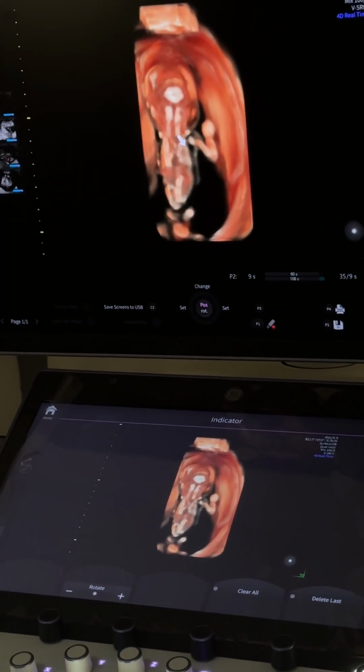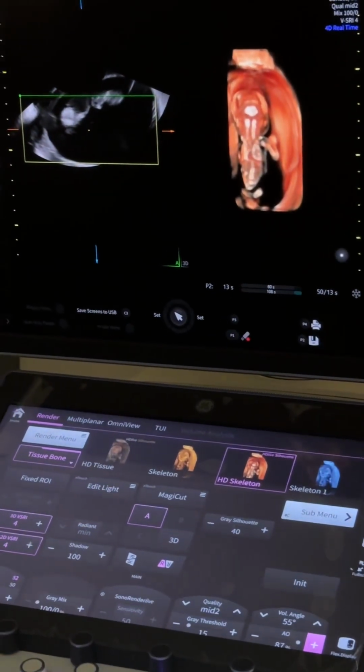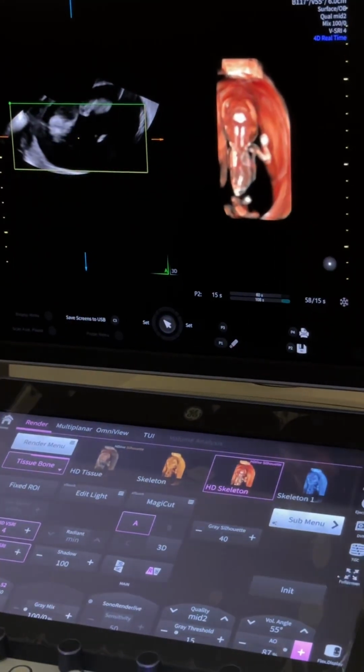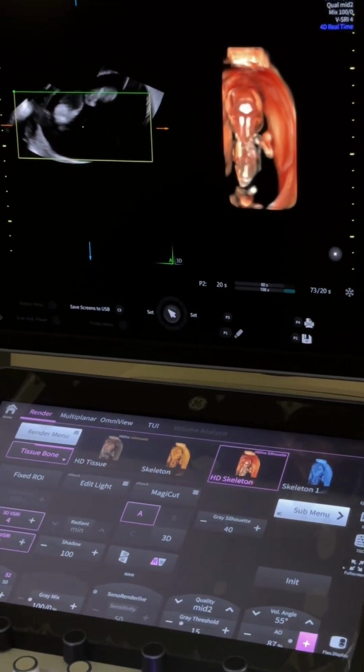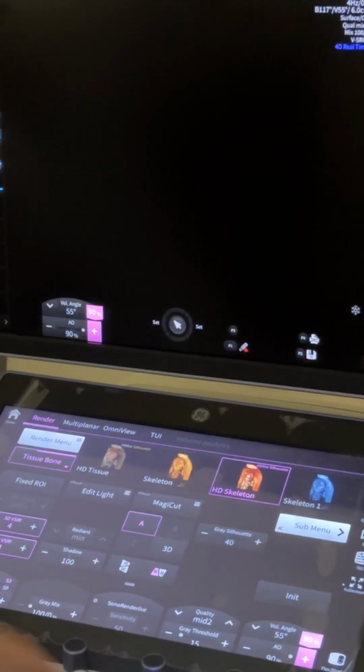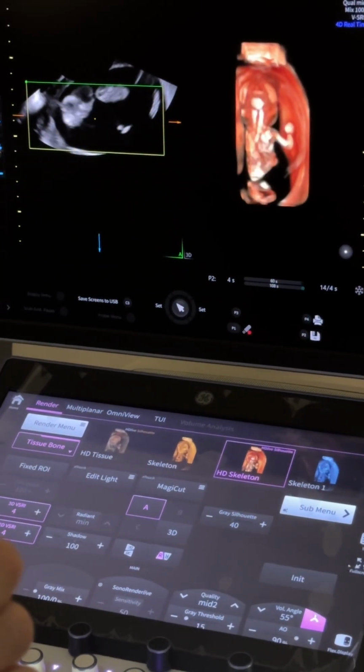If you wonder where you are, you can split the image, and you see that the baby is outside your rendered box, and you can change your render box. Bring that back in. How do I bring it in on real rendered? How do I get my render box back in?